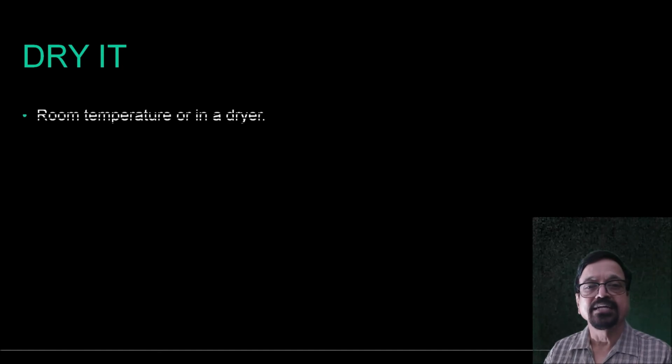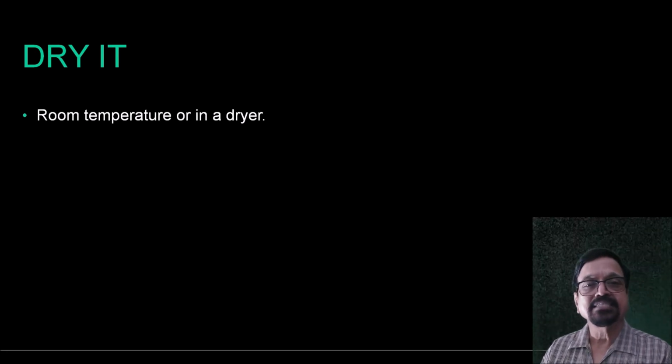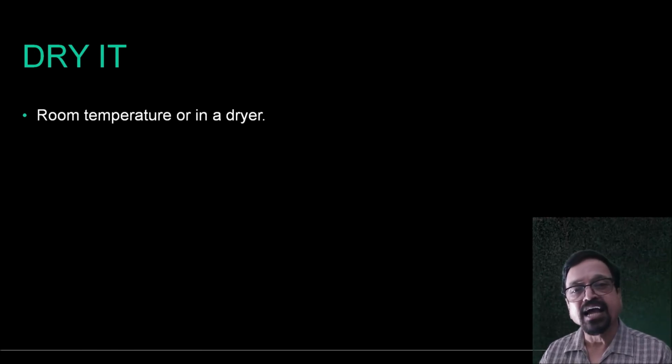Now, drying. For a dryer, it is easy, but at many places there are no dryers. What is done there? The films are kept on a hanger and there are some fans over it. If the room temperature is fairly high, as in most places in our country, we do not need any heated dryers. But heated dryers are preferred in a busy department since they can reduce your time.